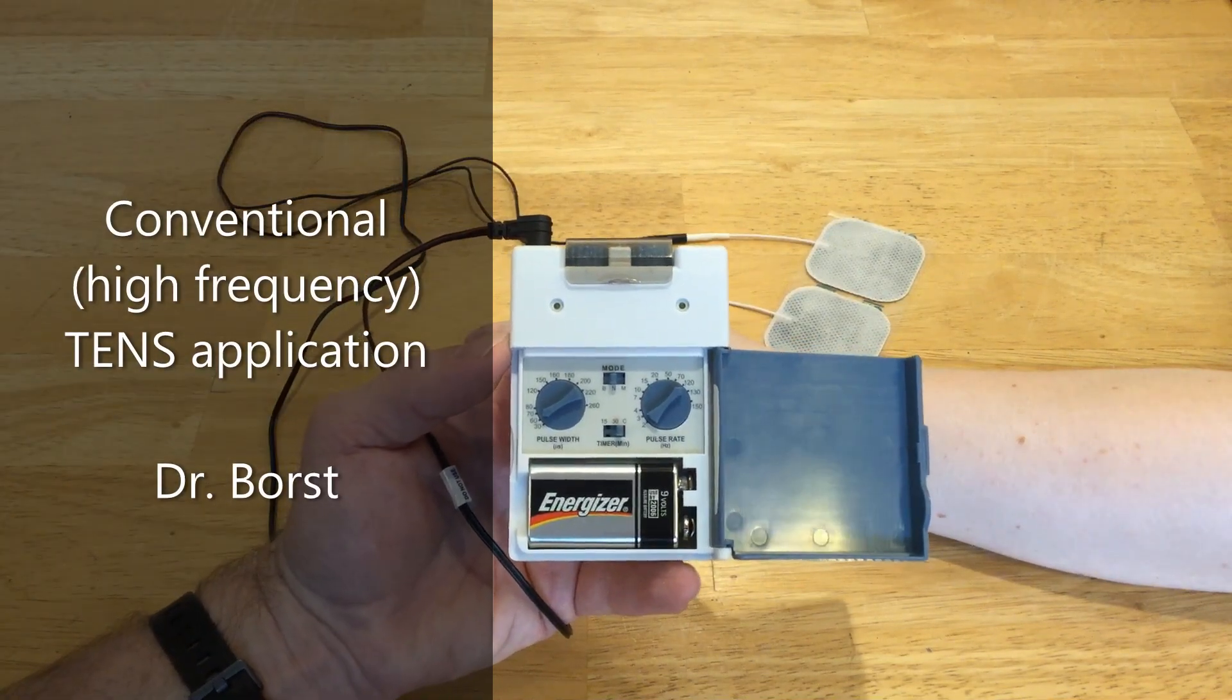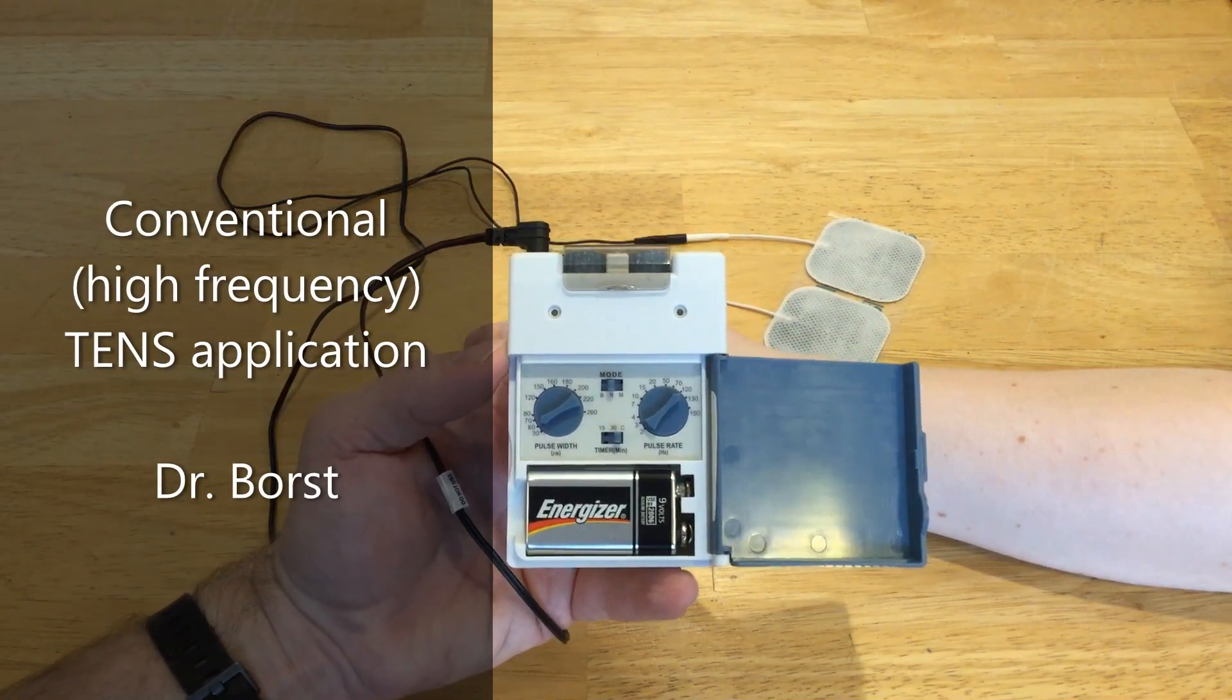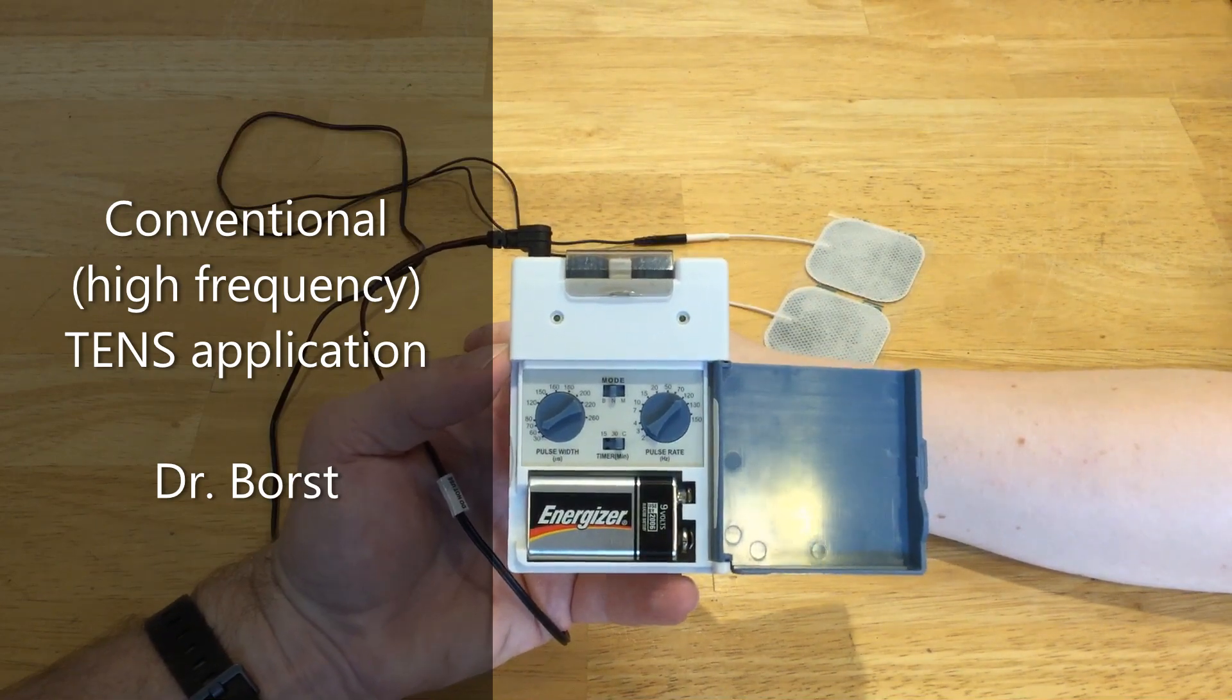In this video, I am going to demonstrate how to apply high-frequency or conventional TENS.